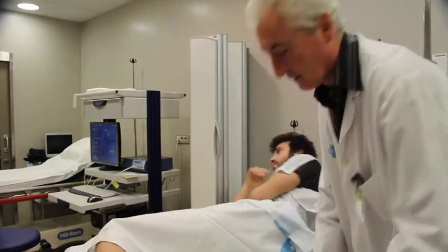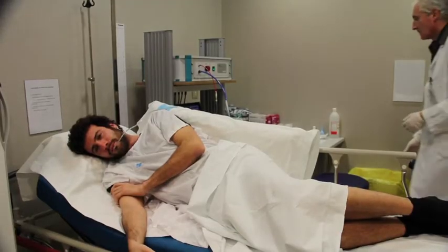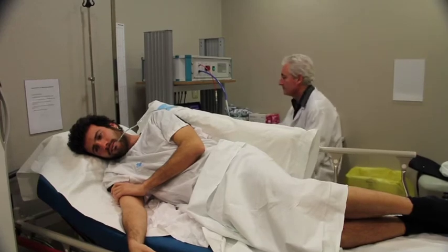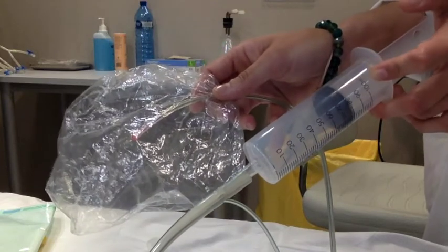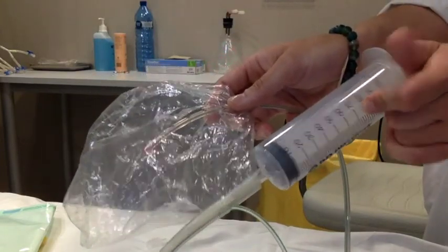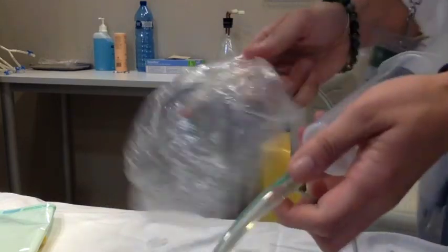Once the bag is positioned, the subjects are asked to lie to the right side so that the fundus is not compressed and the tone can be registered. When the bag is in position, it is important to unfold the bag. Here is an in vitro demonstration of unfolding the bag by infusion of 300 ml of air.